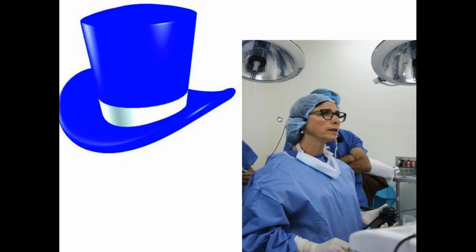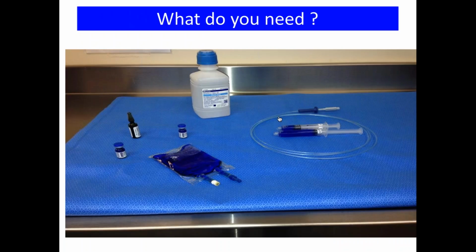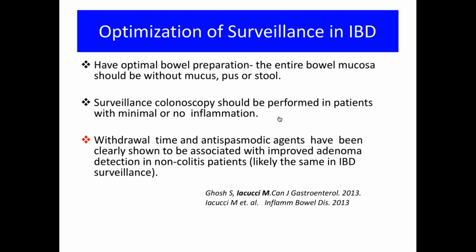So what I do and what I suggest: I like the blue dye, and I use my blue dye for detection. So when I need to perform a surveillance in IBD, I use my blue dye and my dye chromoendoscopy. And what do I need? I normally use my foot pump jet. It's also standard for the SCENIC guidelines, and I put the vials of indigo carmine in 250 milliliters of saline. And then with clockwise or anticlockwise movement of my scope, I just paint uniformly in the colon.